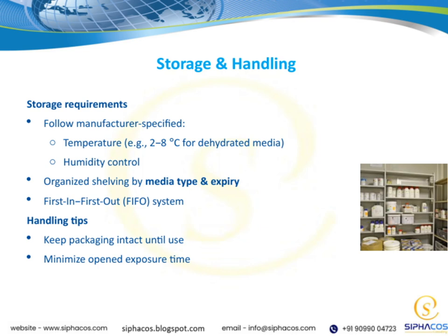When it comes to handling, always keep packaging intact until you're ready to use the media. This helps prevent contamination. Also, try to minimize the exposure of opened packages to the environment. The less time they're open, the lower the risk of contamination. Overall, proper storage and careful handling are key to maintaining the quality and reliability of your media, which supports the integrity of your entire workflow.